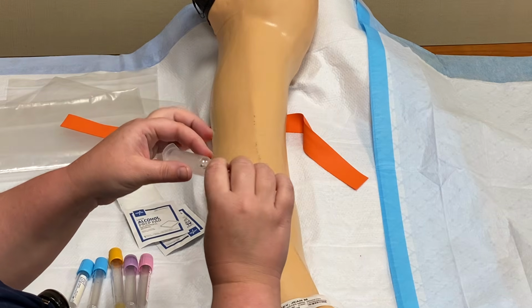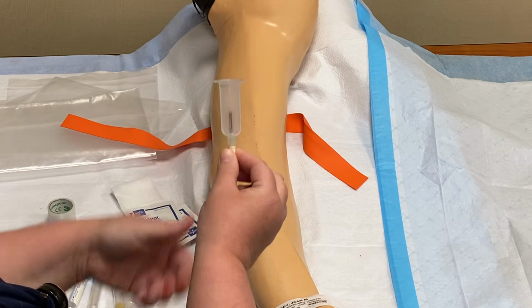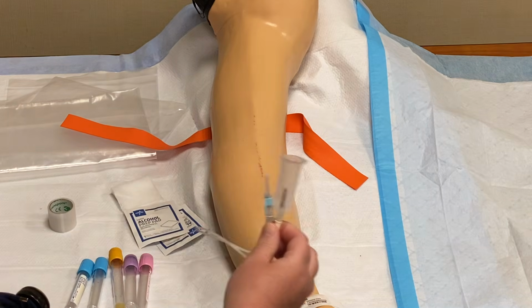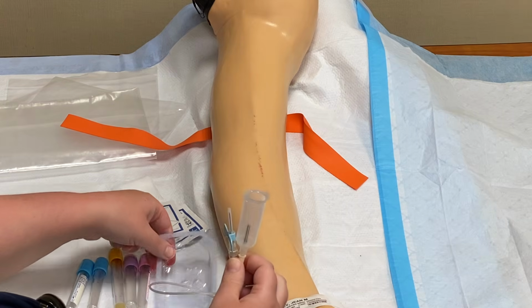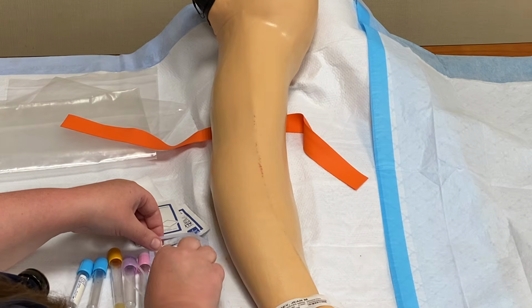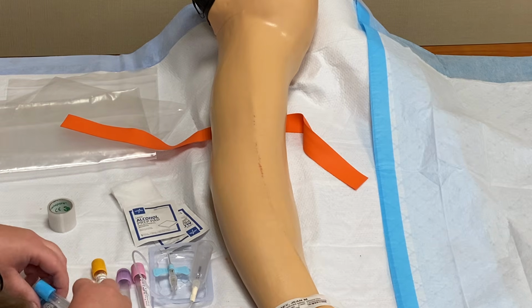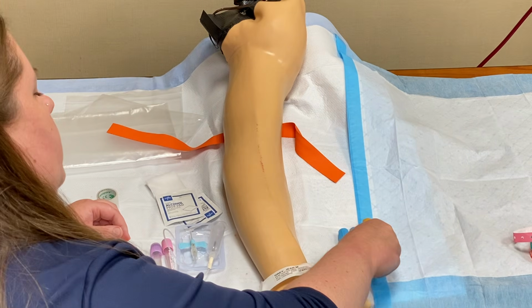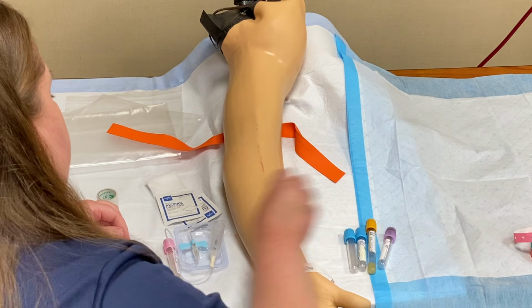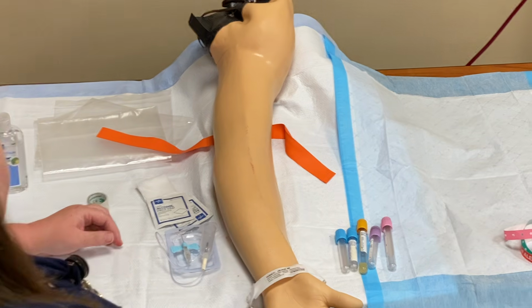I will twist my Vacutainer holder onto the needle, and I want to make sure that this connection is tight as well. Once I have that set up, I can just leave it sitting in its container, and that way it's nice and organized. I want to make sure that I have my tubes arranged in the order of the draw. So blue goes first, then gold, lavender, and pink. So I have all of my supplies set up.